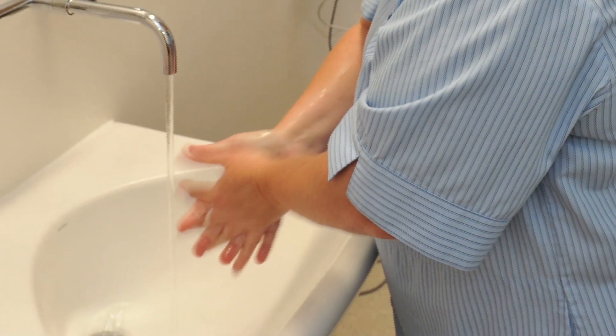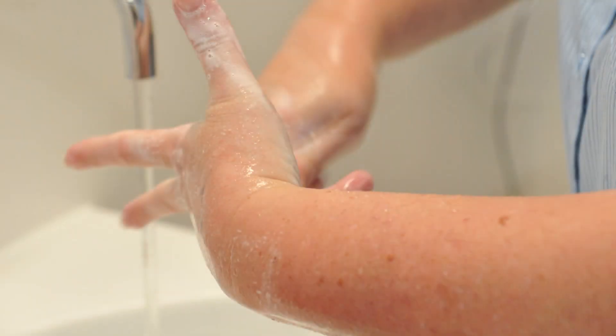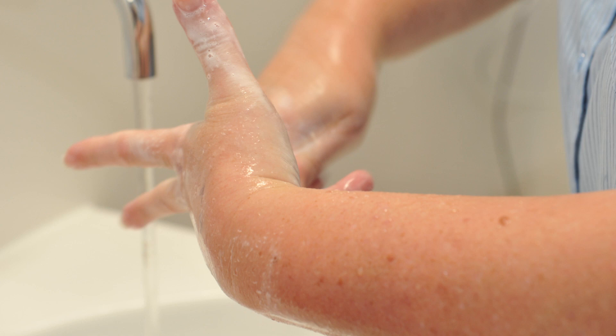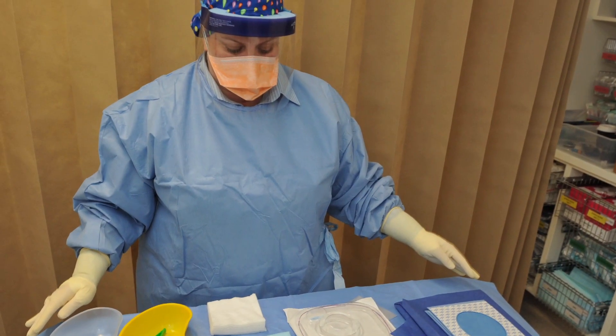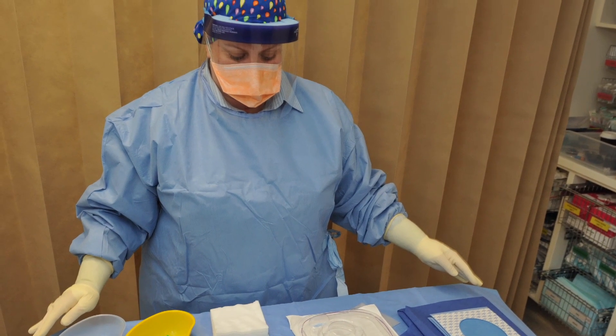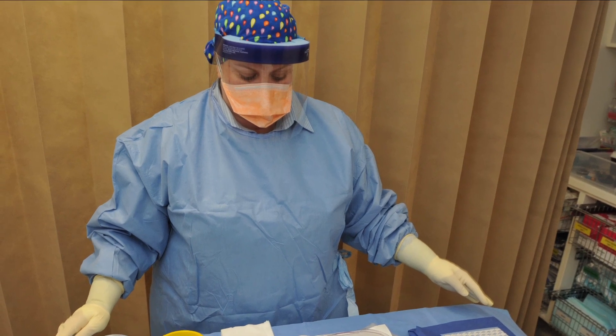A surgical scrub should be performed, and personal protective equipment including a hat, face mask, eye protection, full-length sterile gown and gloves should be worn.